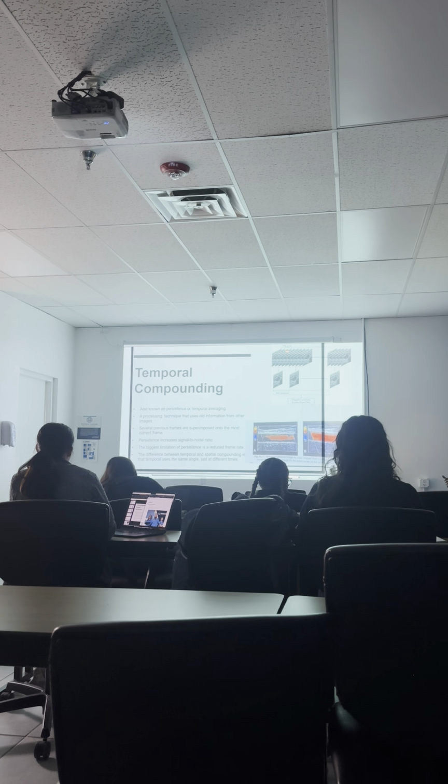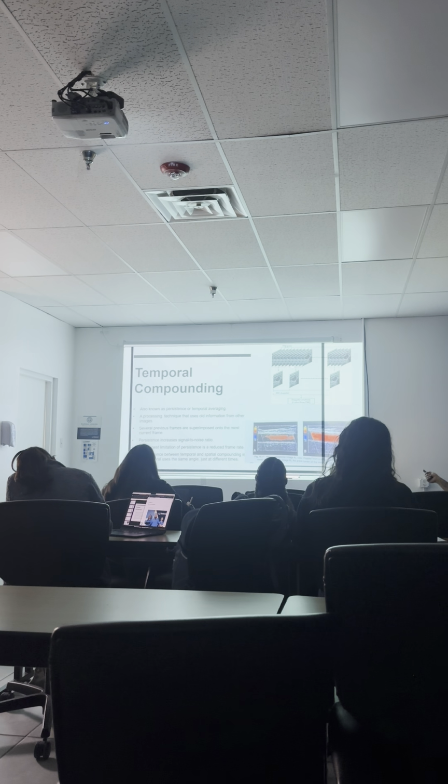Which one do you think would have a better resolution? The one with the more frames in it. Yes, the one with the more frames would have a better spatial resolution, right? Which means that we could see the structure a lot clearer than this one, right? Okay, but what are we dealing with here? Time. We're dealing with more processing. More frames, right? So what does more frames do? More processing time.